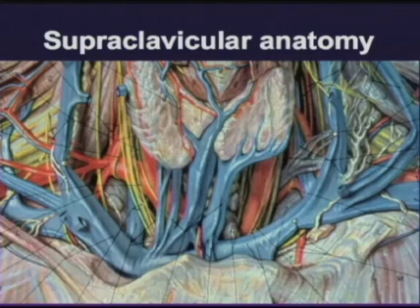The anatomy of the upper extremity veins is quite different than the lower extremity in that we have the bony thorax, which covers many of the veins, and the presence of numerous collateral vessels and numerous other vessels which are present besides the large veins that we evaluate. And these veins can grow quite large as collateral vessels and can mimic the veins that we typically study.